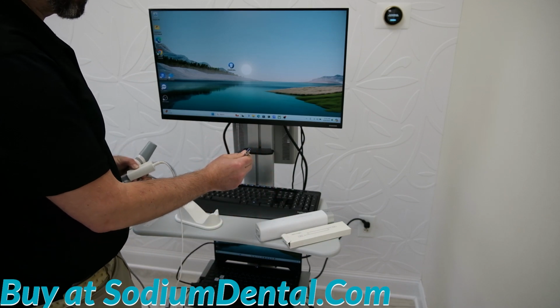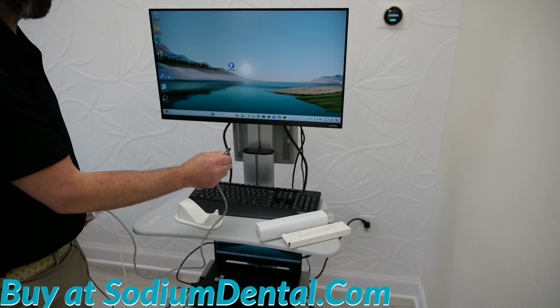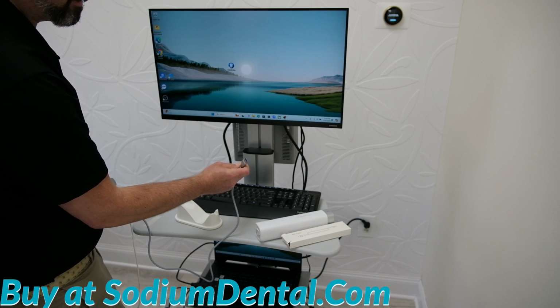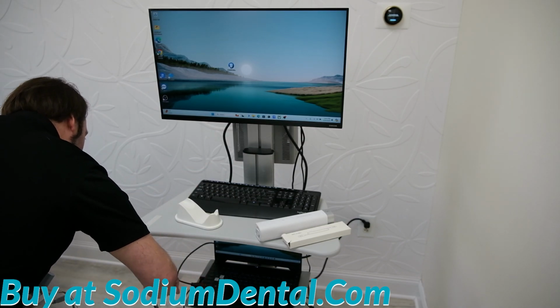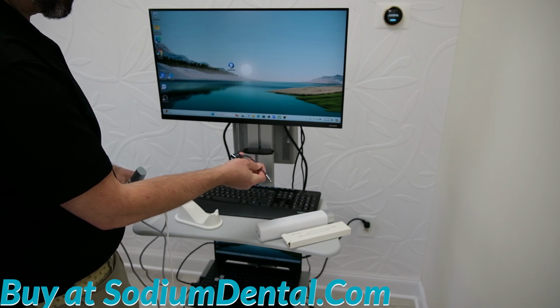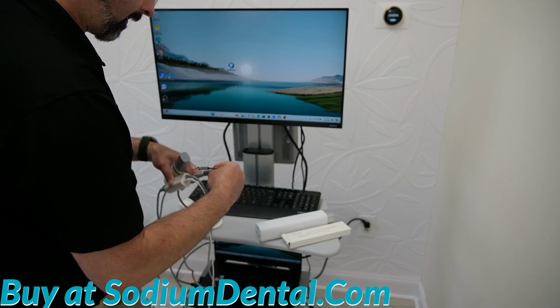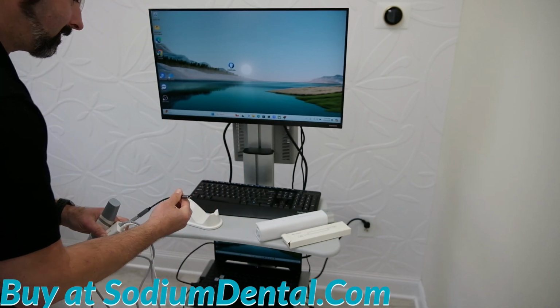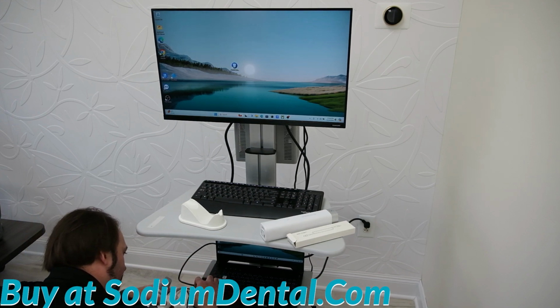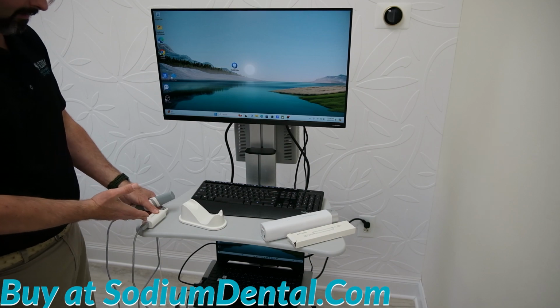Then, take this USB-A connector and plug it into a USB 3.0 port on your computer. If your computer does not have a port that looks like this, but instead has a port that looks like this, a small $5 adapter will convert USB-A to USB-C. So you can plug into here and then plug this into your USB-C adapter. We like to Velcro this connection here.